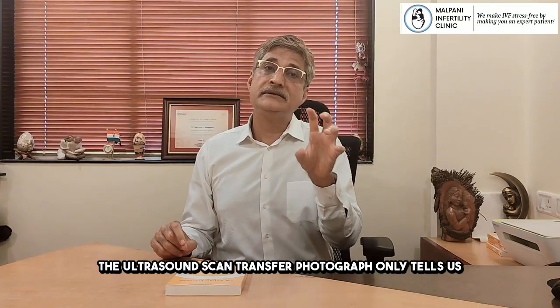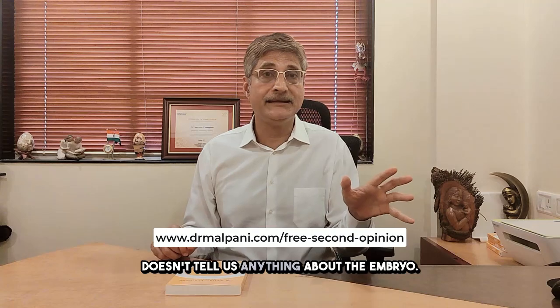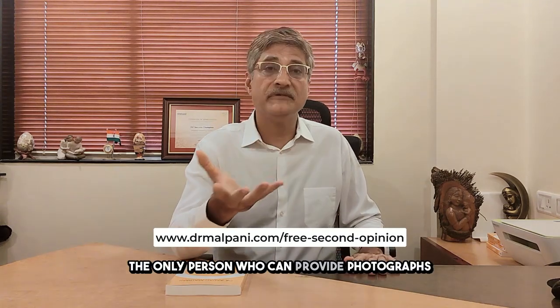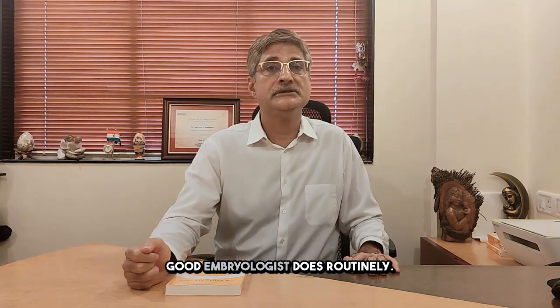The ultrasound scan transfer photograph only tells us we put the embryo in the uterine cavity. It doesn't tell us anything about the embryo. The only person who can provide photographs of the embryo is the embryologist. And this is something every good embryologist does routinely.